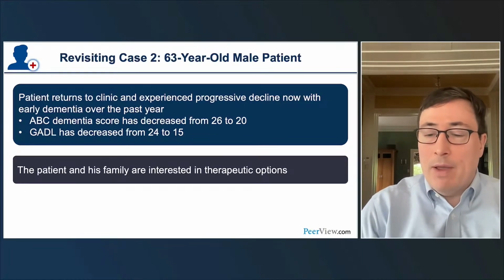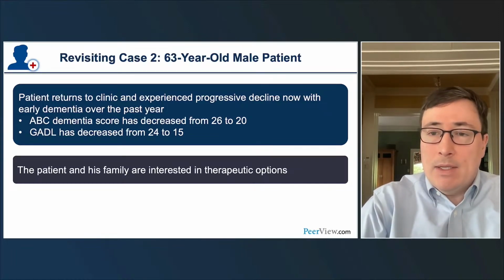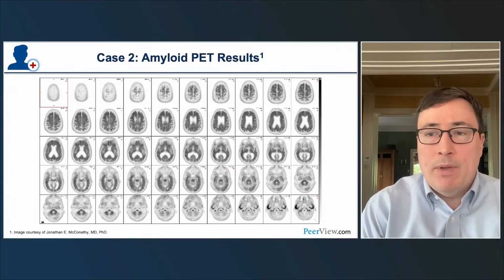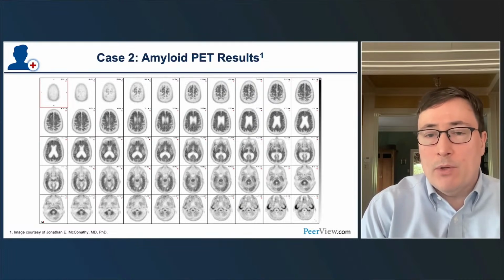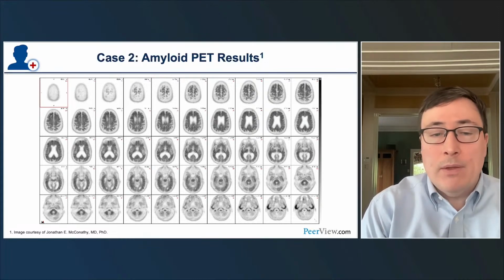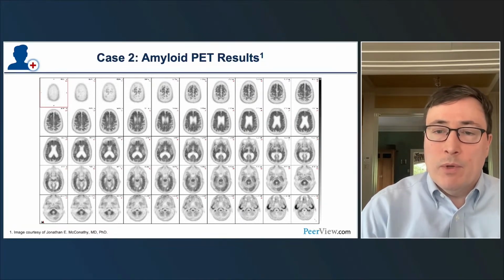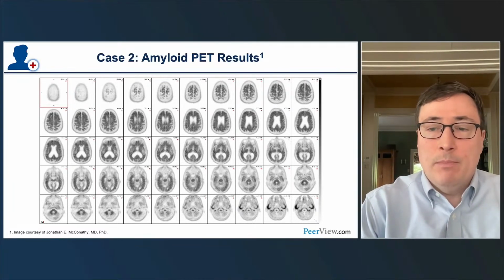And so in the area of anti-amyloid therapy, a key question is does he have Alzheimer's disease, and is he a candidate for an anti-amyloid antibody? So here are the results from the patient's amyloid PET performed to determine if he was a candidate for therapy. You can see that there's loss of gray white matter differentiation throughout the cerebral cortex, indicating abnormal amyloid in the cortex. And importantly, there's normal gray white differentiation in the cerebellum, which we use as our visual reference for determining whether or not there's loss of cerebral gray white matter differentiation with the tracer florbetapir.